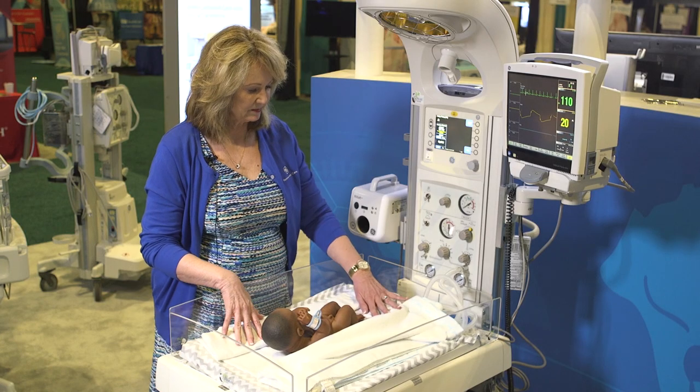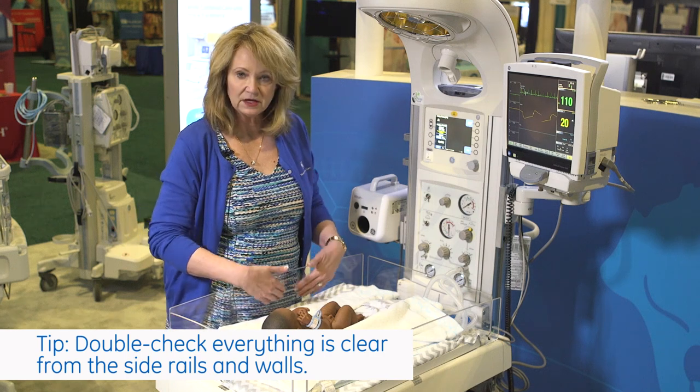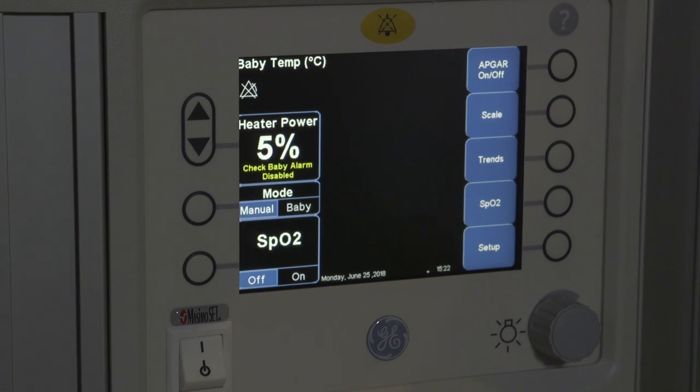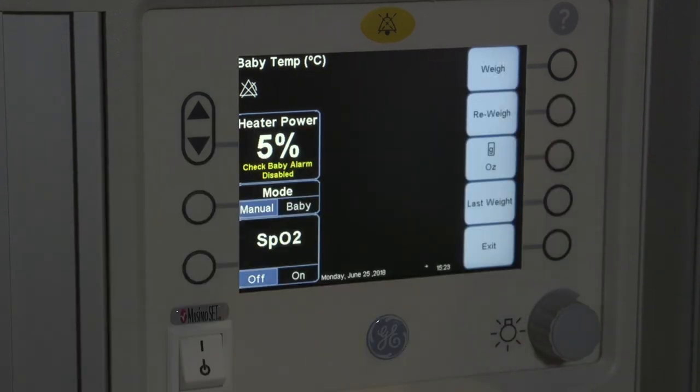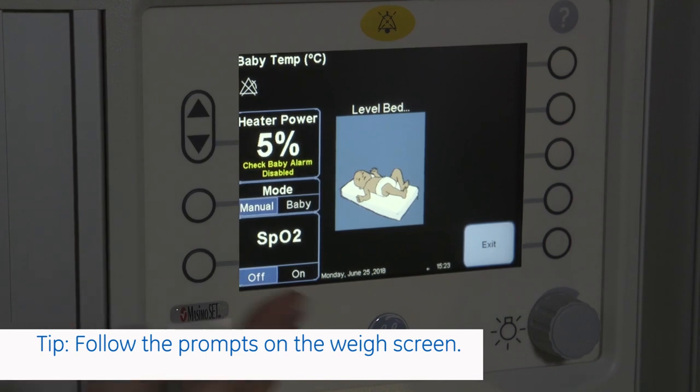Once your bed is level and everything is cleared away from the sidewalls, then you can go to Menu, find your Scale, and then go to Weigh. The prompts will guide you through weighing the baby.